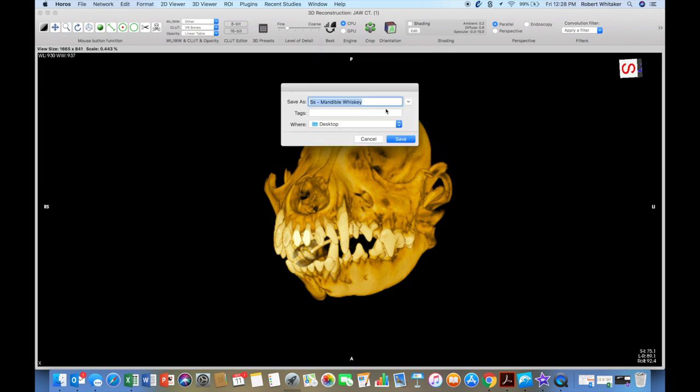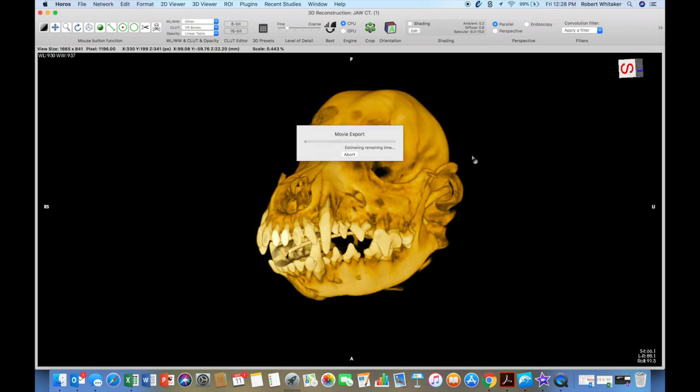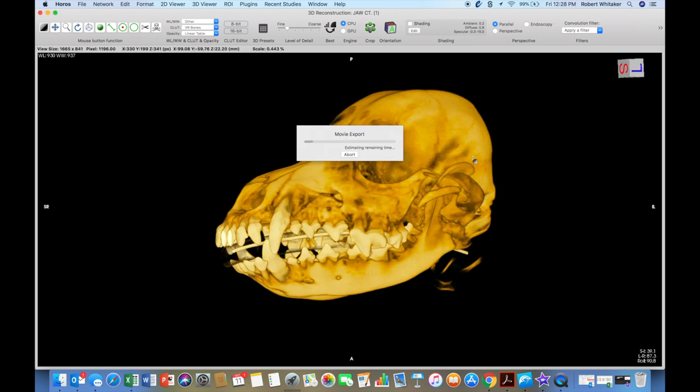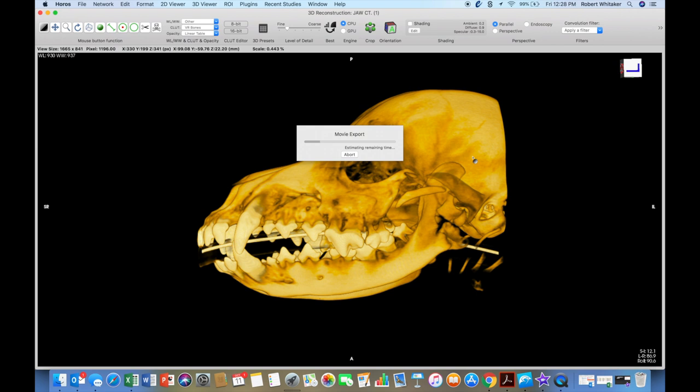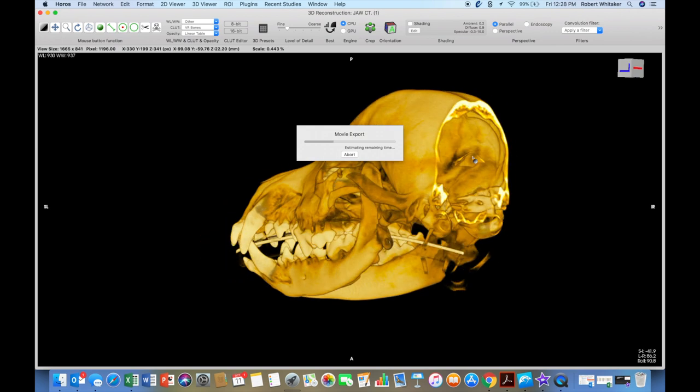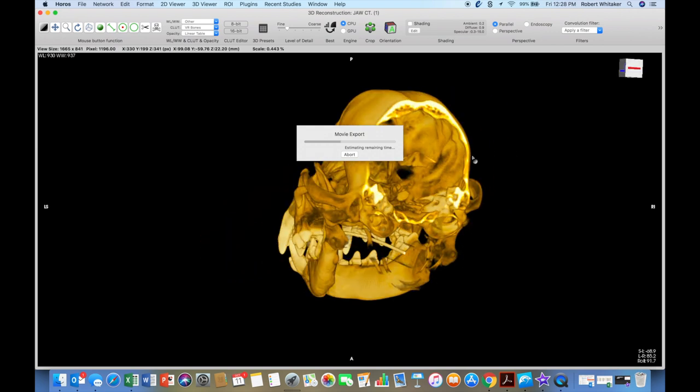It's going to ask me to name it. So I'm going to call it Color 3D Dental Skull. You can name it whatever you want. I'm choosing, I'm going to the desktop with it. I'm going to save. So now it's going to take off and render this rotating skull into a short video.